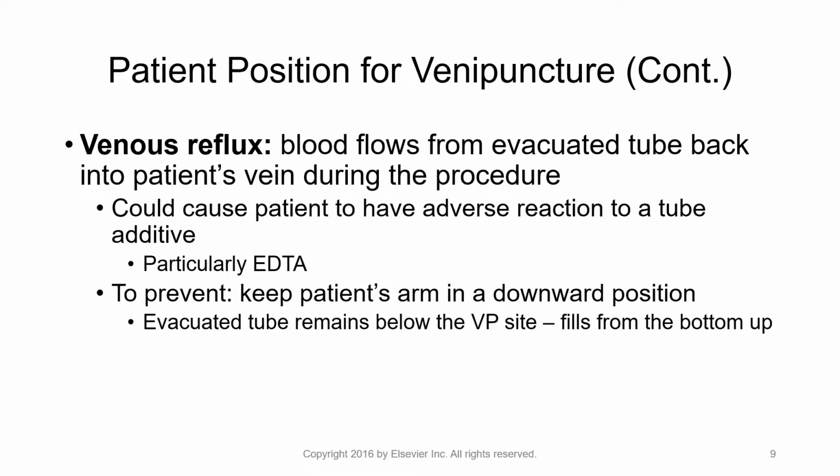You do this by keeping the patient's arm in a downward position. The evacuated tube remains below the venipuncture site, so the tube fills from the bottom to the top and is not filling from top to bottom and potentially adding blood back into the body.